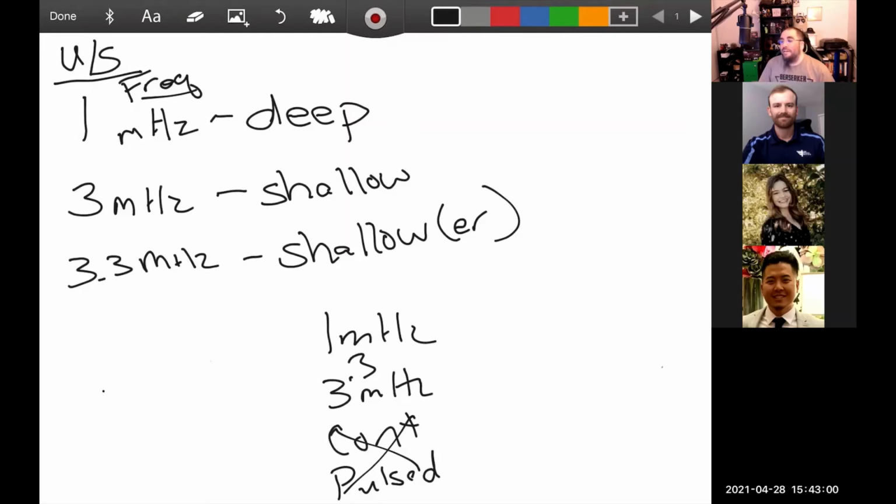Okay. Right? A precaution would be, yes, definitely if you're going towards the spine, that's a precaution. That'd be where you're going to protect it. Okay. And if you're not comfortable, that may be one where you say, hey, can I see how you do that? If you're a student, right? Can I see how you do the ultrasound in that area so that I can mimic you? Okay.